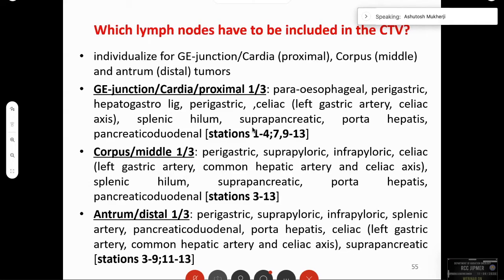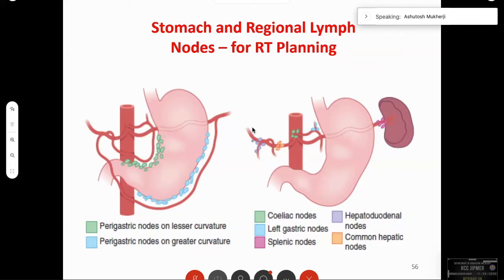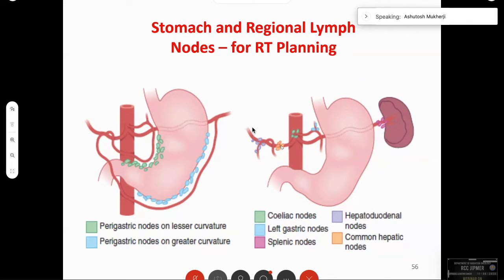These are the standard nodal areas recommended in the CRITICS protocol, textbooks, and the Nancy Lee textbook for contouring. The stomach and regional nodes for RT planning include the perigastric nodes on the lesser and greater curvature, the celiac nodes, common hepatic nodes, left gastric nodes, hepatoduodenal nodes, and splenic nodes.